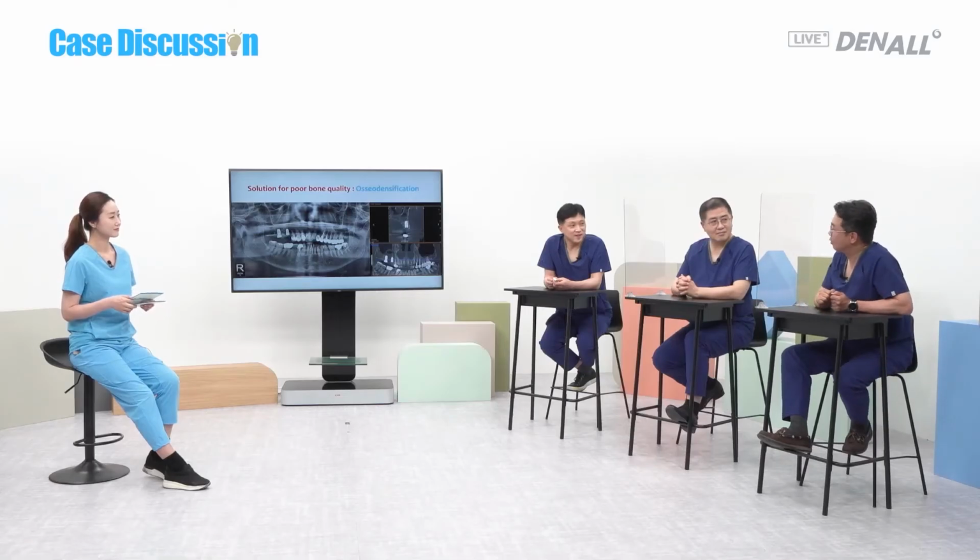I have a question for both of you. I do the under drilling. Dr. Son and Dr. Kim also do the under drilling. One of you uses the template, one guide, and one of you doesn't.